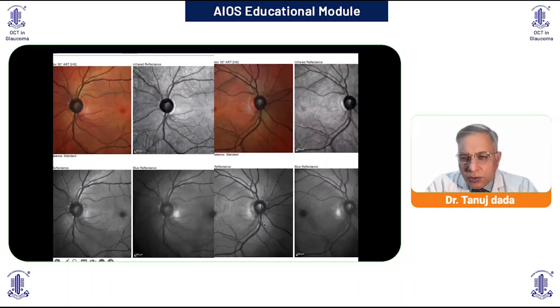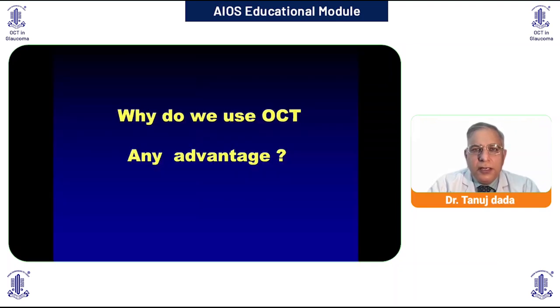So you are now sure that there is a defect in the retinal nerve fiber layer, and the OCT can go ahead and confirm this defect. But clinically, you've already made up your mind that there is a RNFL defect visible on the multicolor photograph obtained on the OCT.